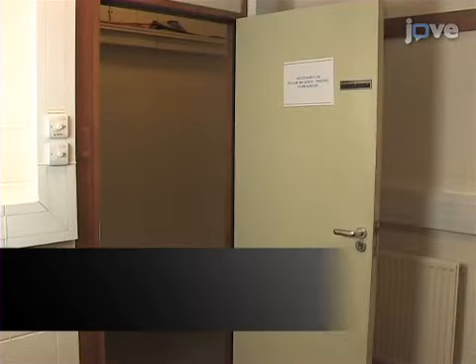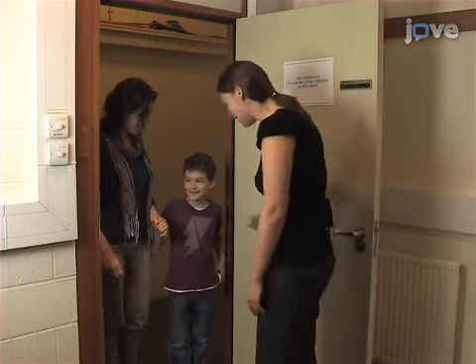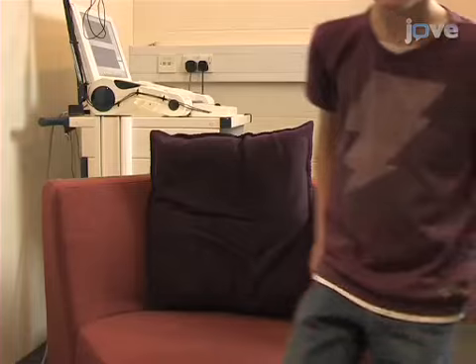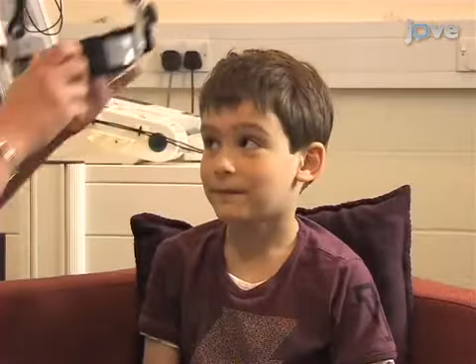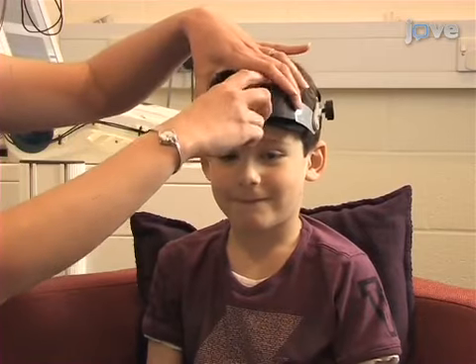Before starting a session, it is important to check whether the child needs to go to the toilet. Seat the child comfortably, as the sessions last between 20 to 30 minutes and gross motor movements can interfere with the Doppler signal. Demonstrate the Doppler headset for the participant using a toy animal. Make sure the child is happy to put on the headset and position it comfortably and firmly.